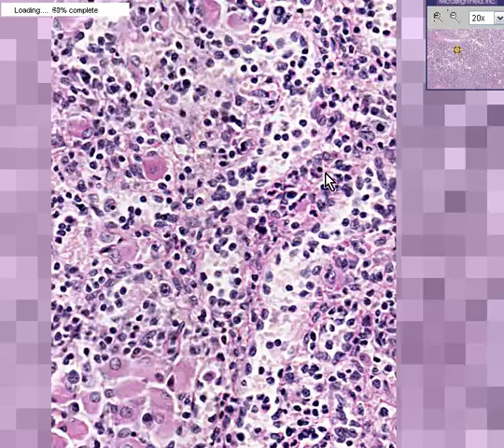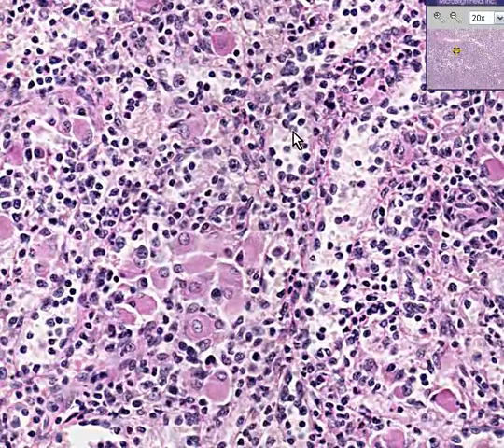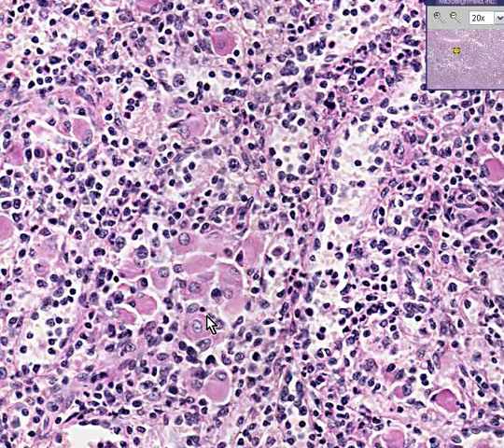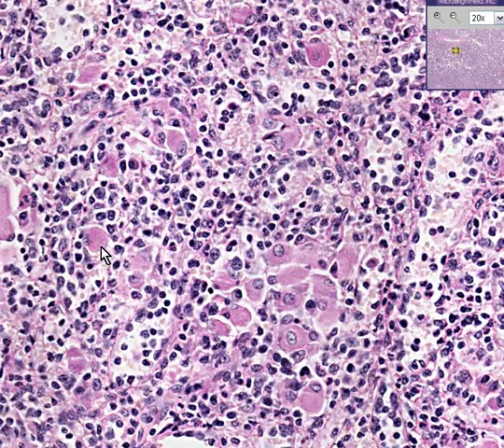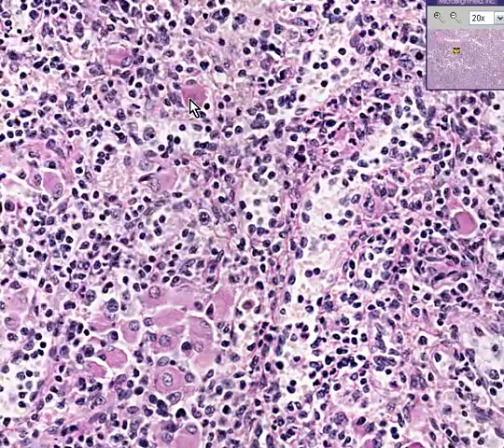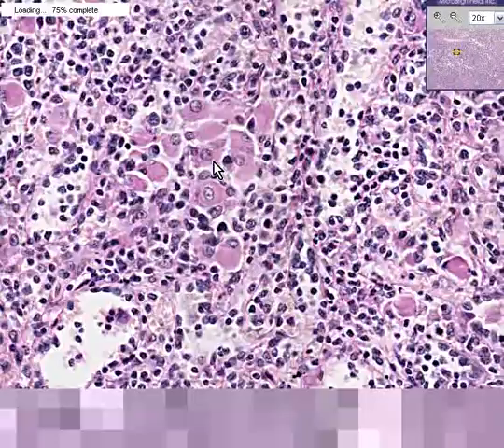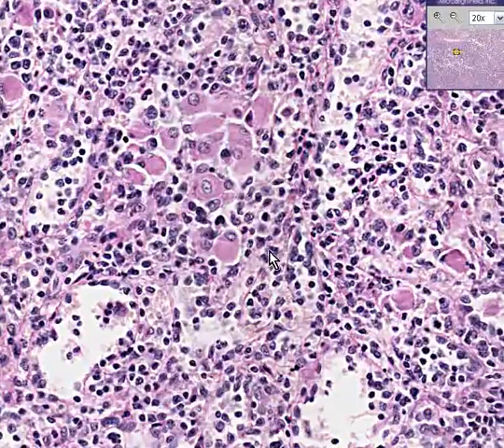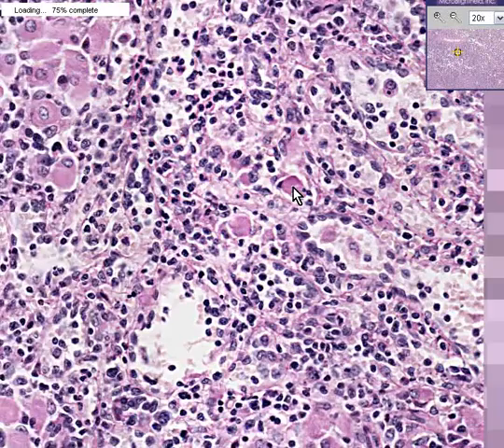Well, if you look at a lot of spleens, the first thing you'll notice is that all of these cells here — all these pink cells with abundant fuzzy cytoplasm — you normally shouldn't see in the spleen.